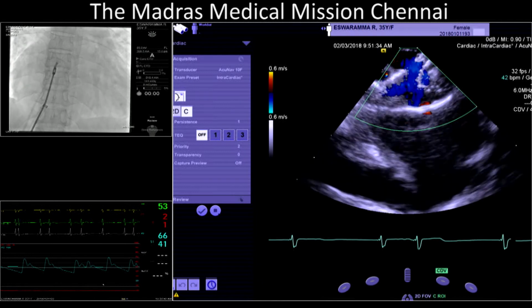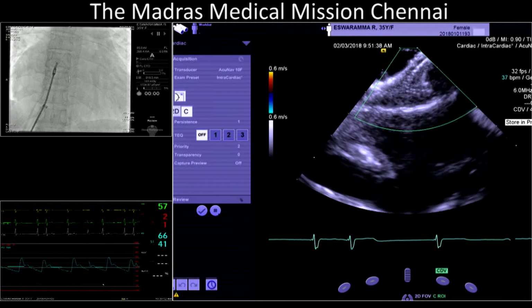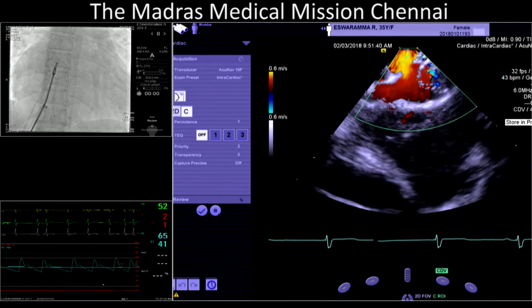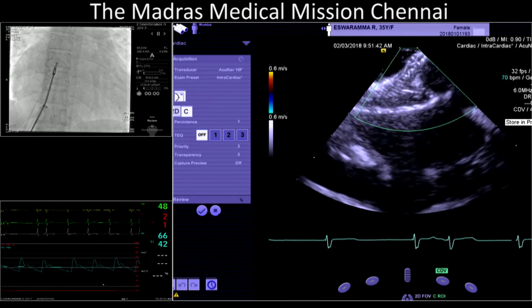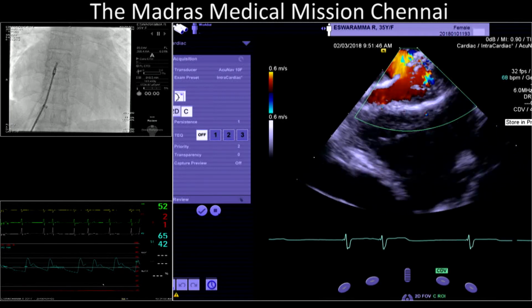Shiva, did you give a little bit of epinephrine? No, I gave atropine, 20. I would give epinephrine, not atropine. We should move on otherwise, because the patient has a very low pressure and heart rate.